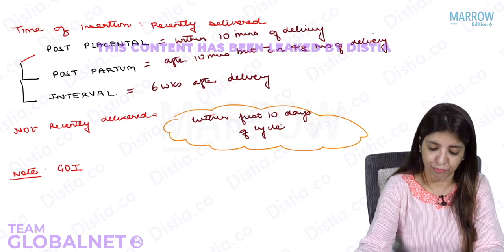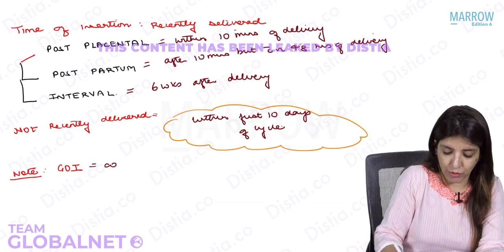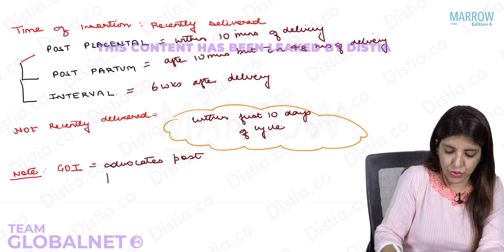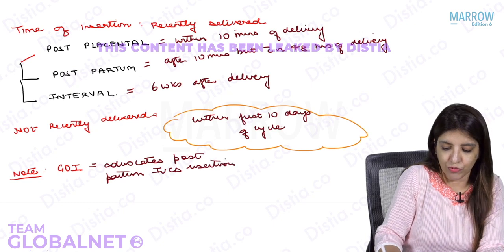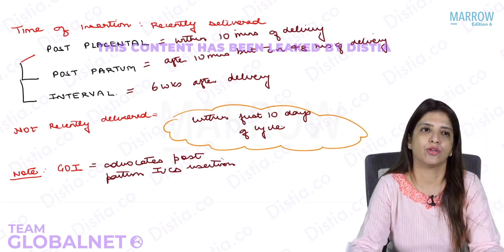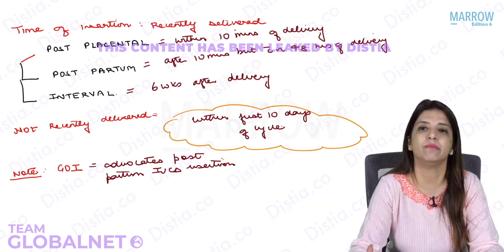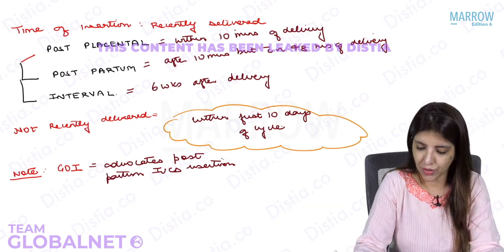Please remember, Government of India advocates postpartum IUCD insertion. Postpartum IUCD insertion. So Government of India says that you should motivate a female who has delivered to go for postpartum IUCD insertion, right?